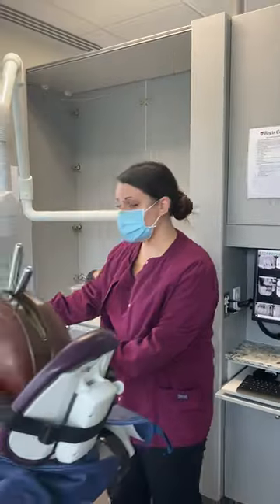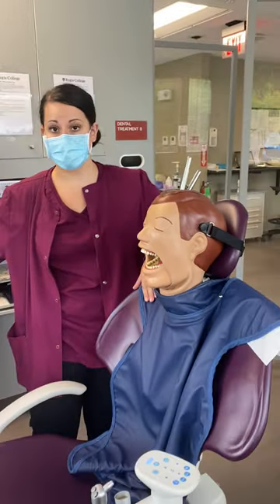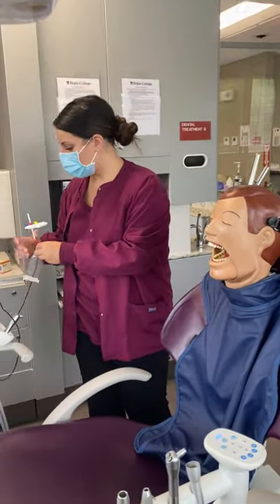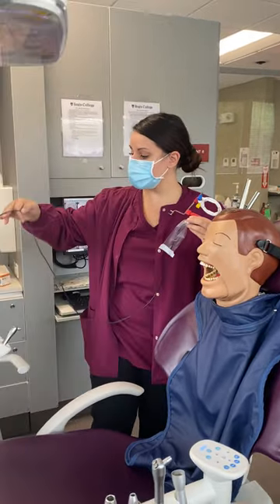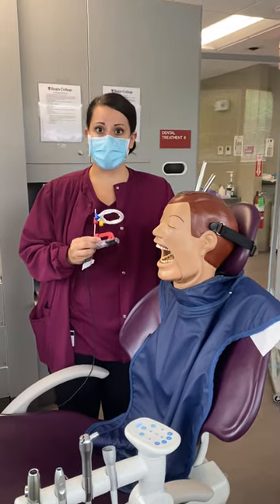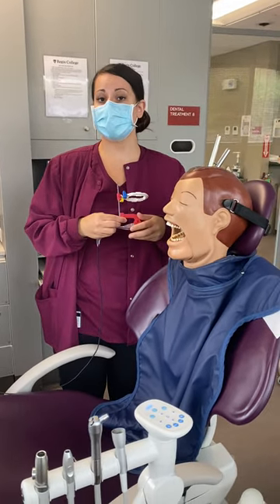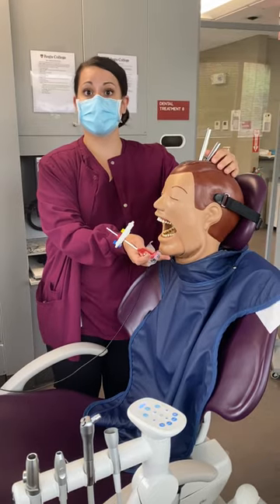So I'm going to come over here. In lab, even though Dexter's not a real person, we always want to make sure he has a lead apron on. We're always going to work on the right side of our patient. You might be in an office where you physically cannot get on the left side, so we always stay on the right side of our patients during exposure.